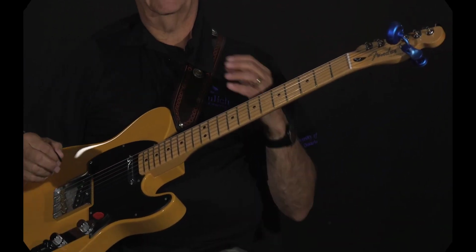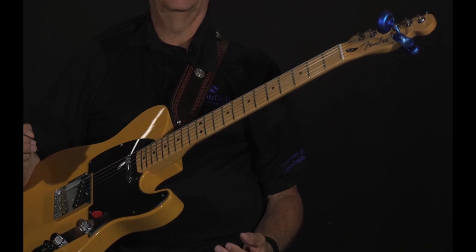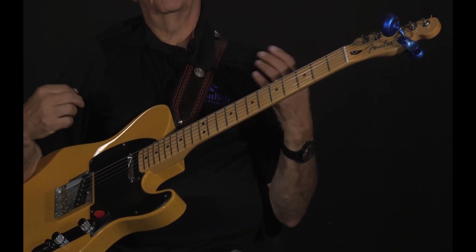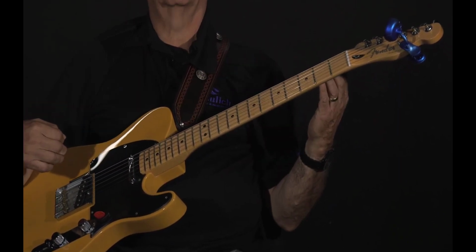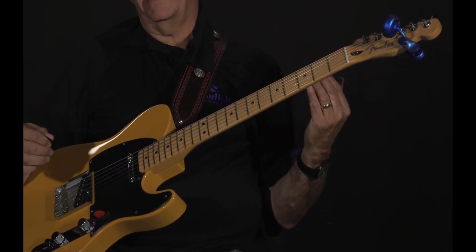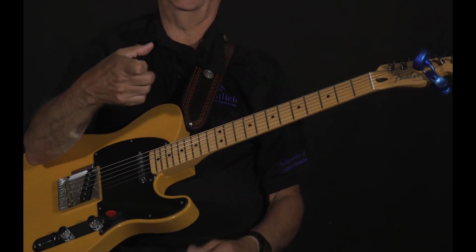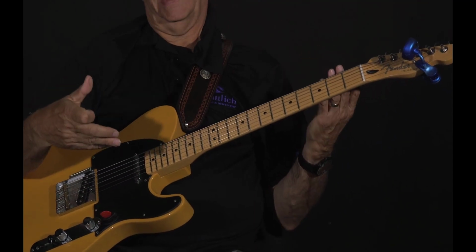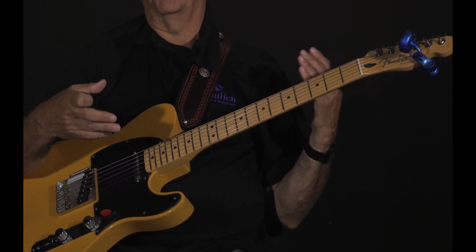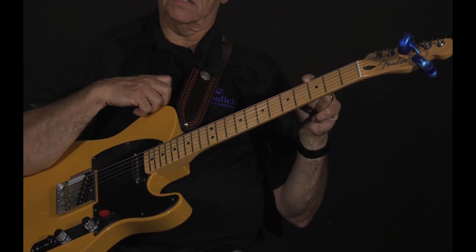Another variable that affects frequency on a guitar string is the length of the string. This might not seem intuitive, but you can change the length of a string interactively on the guitar. It would be very impractical if every time you played a different note, you had to reach out to some pliers and snippers and cut the string to the length of the note you want to play. So that's impractical. The way that we do it practically is by using these metallic bars or frets.